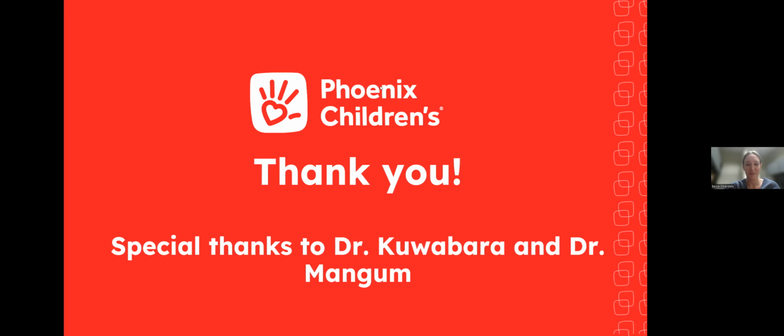Thank you, Dr. Bhatia. Another question for me. Are there any sequences that are most susceptible to artifacts, or is it that each artifact can affect different sequences different ways, and there doesn't seem to be one that's... No, from my understanding, there doesn't seem to be one that's more susceptible to artifacts. I think it's more the field of view, so what you're looking at, if it's axial versus coronal versus sagittal, and those interfaces, and how much of the image you're actually looking at. I don't think there was any sequence that was particularly more susceptible.